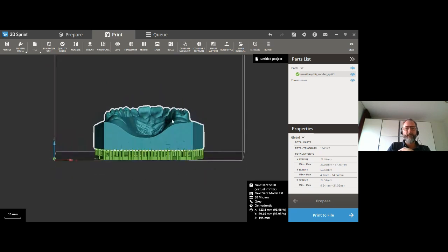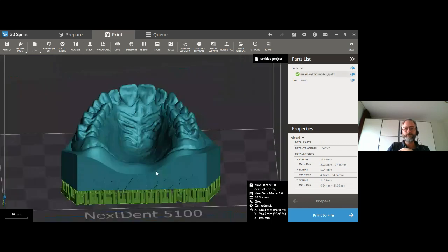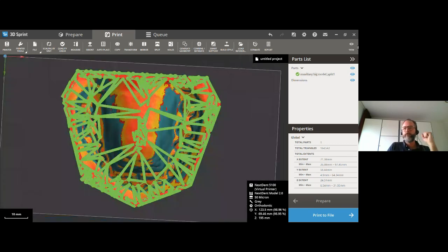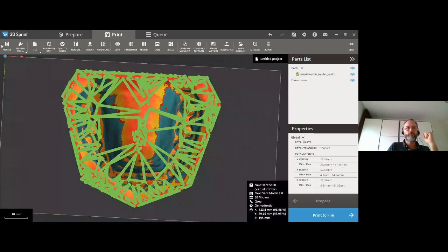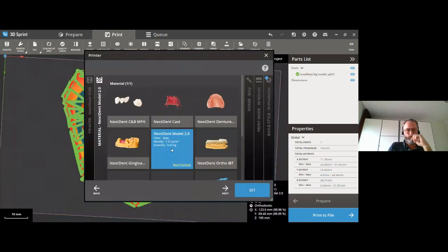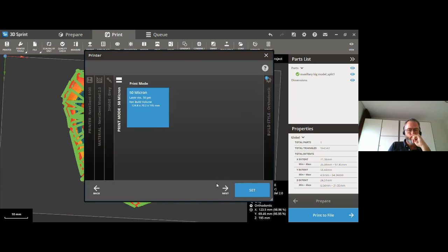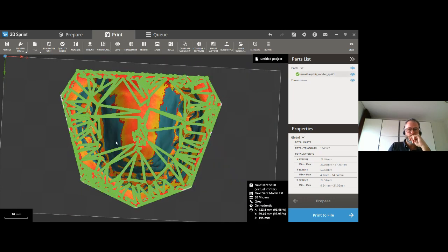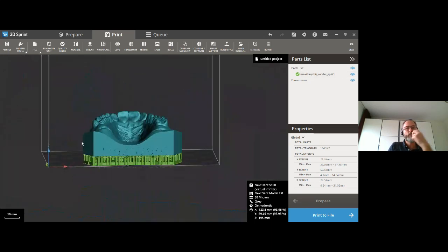That's great. That's awesome. I have currently two more questions, and they are related to this topic. One question is, when you go into your printer settings and you select a build style, for example, for models, you can choose between orthodontic, prosthodontic, and premium. But later, when you do the smart support, some very smart people have noticed that you can also choose between orthodontic, prosthodontic, and premium in different sizes. Will this override the build style is one of the questions. Of course, it will not, but you can explain that. And what is the difference there?